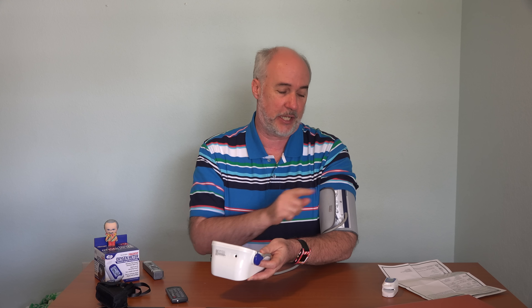In addition to the fingertip oxygen meter, there are a number of other devices that you can check your own numbers at home, including a blood pressure monitor. I'm going to use it right now to compare the pulse rate and see if it's about 62. Blood pressure 113 over 73 with a pulse of 63 — this one read 62, pretty good. I researched blood pressure machines pretty thoroughly before deciding on this OMRON model, though it's several years old now and there's a newer model. I'll link to my review of it down below.